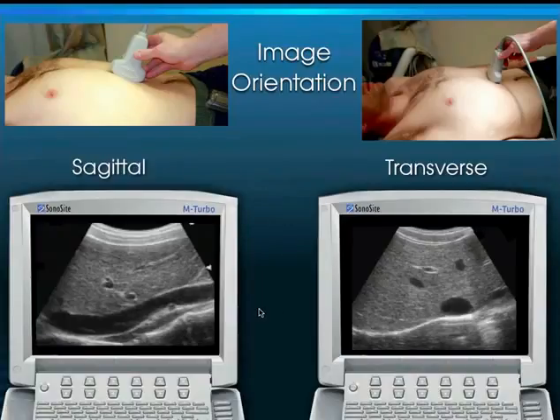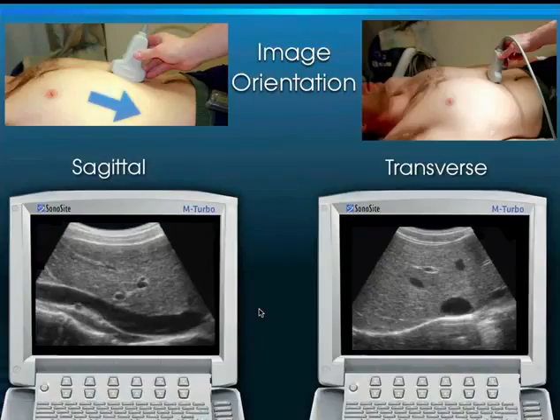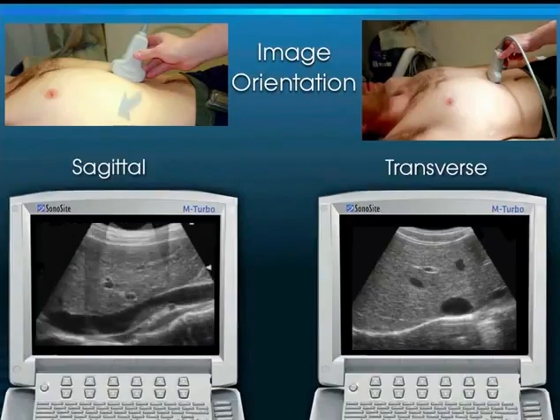But if I accidentally aim the indicator down towards the feet because I wasn't paying attention, well, now this IVC is upside down. And when that IVC is upside down, while you can still interpret it, it's an upside down image and goes against the convention in the United States. And over time, that appearance should feel like fingernails on a chalkboard to you. So I'm going to turn it back right now because that's having that effect on me.